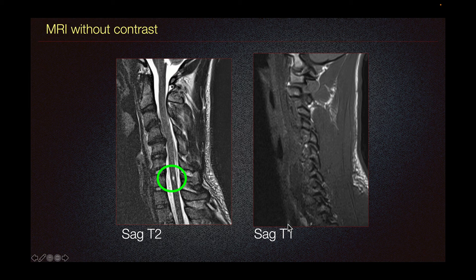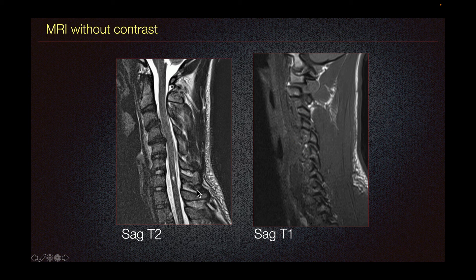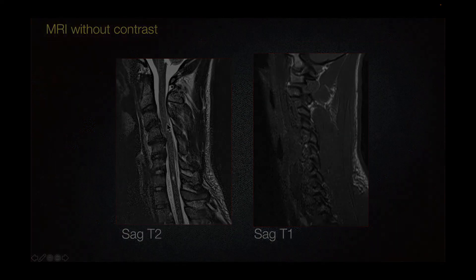On our sagittal T1 imaging, we can again see the perched facet of C4 over C5 and the displaced fracture, as seen here. We also look for possible epidural hematoma or any kind of abnormal cord signal.